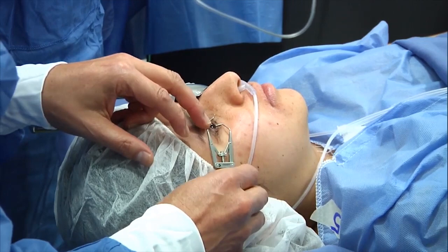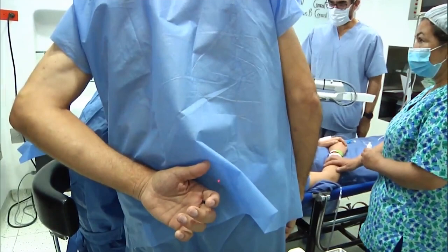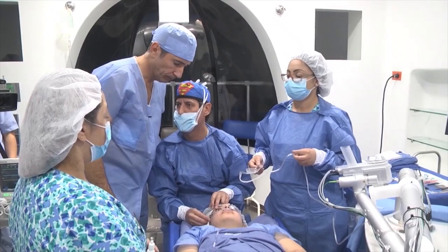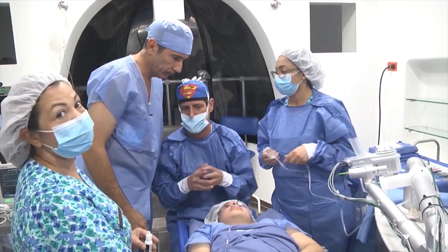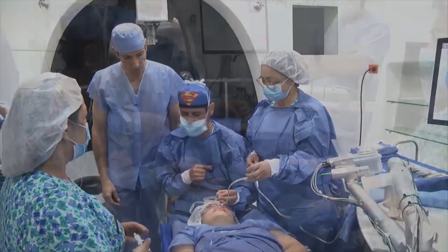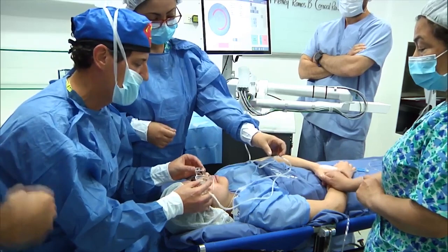Here we are with Dr. Ernesto Otero. Hello, Ernesto. Buonasera to everyone. Hello, how's everything? So here we're going to start the procedure. We already have the speculum placed in the eye, and we're going to proceed to do the docking of the femto laser as we usually do. We placed some marks on the eye at 0 and 180 degrees to align the suction ring onto the eye. So now I'm going to proceed.